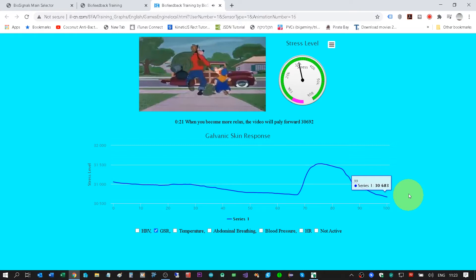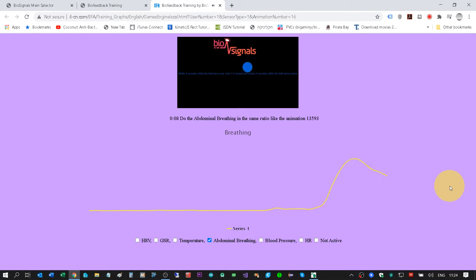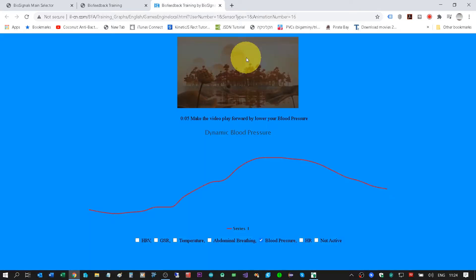You can see your breathing waves — very simple waves. Each graph will start to scroll to the left after five minutes. Blood pressure uses the same idea: when the blood pressure goes up the video stops, when the blood pressure goes down the video plays. Very simple.